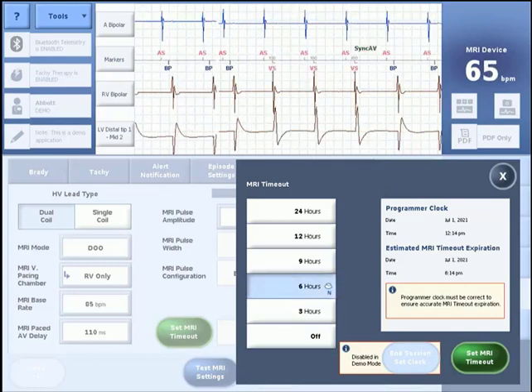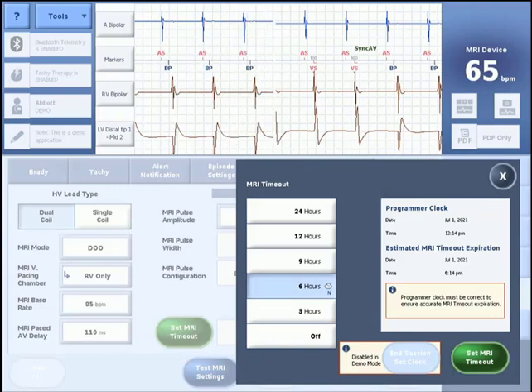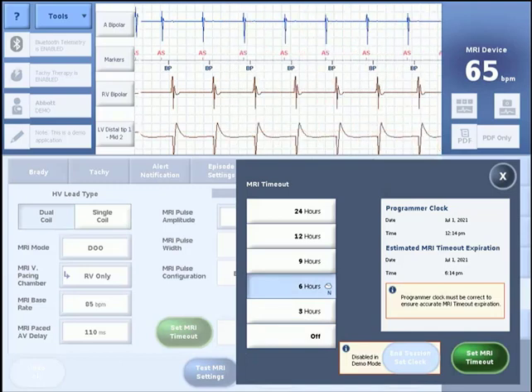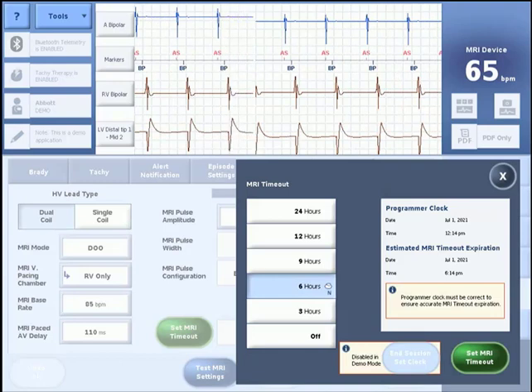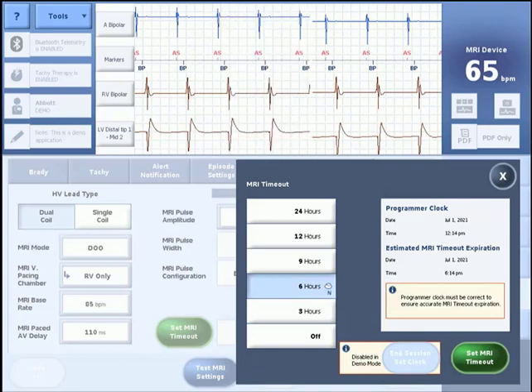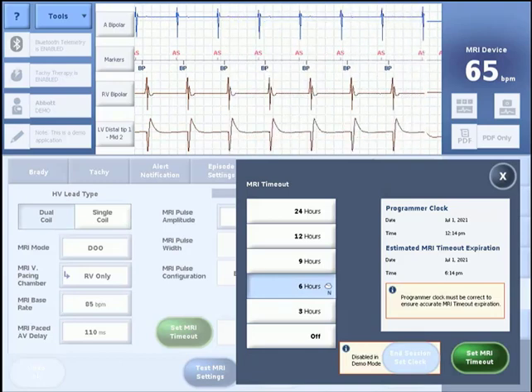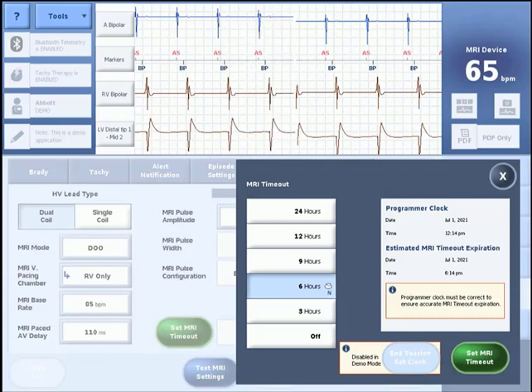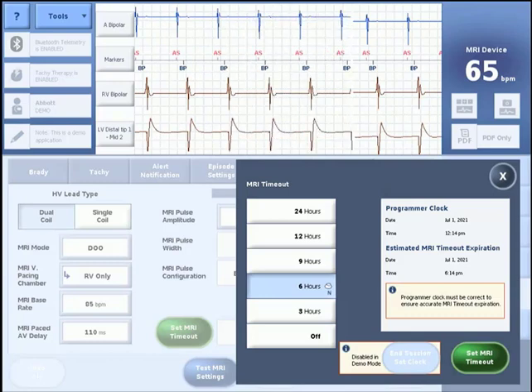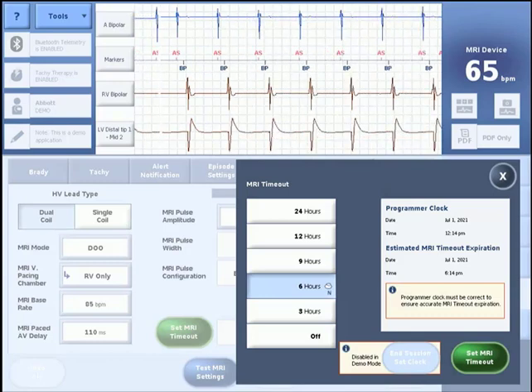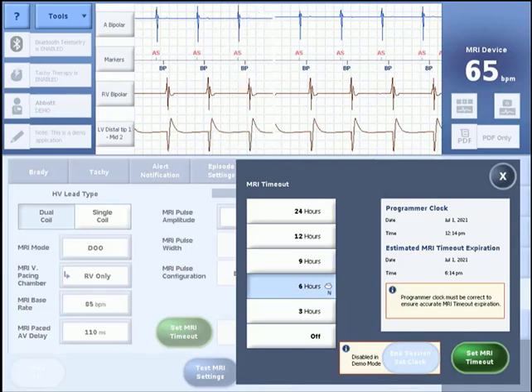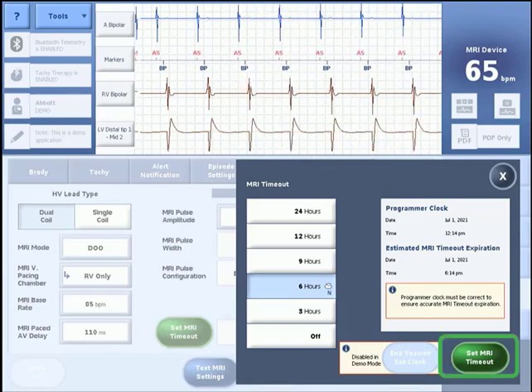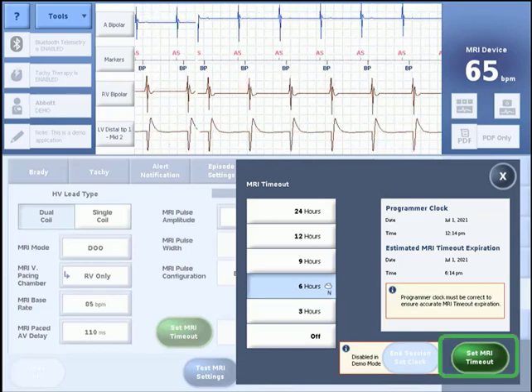It is important to remember that a patient will not receive any tachycardia therapy as long as the device remains in MRI settings. Even if an MRI timeout duration is chosen, it is recommended that the patient's device is interrogated following the completion of the scan so that they can be put back into permanently programmed settings and therapy can be re-enabled. Once a setting for this parameter is chosen, click the Set MRI Timeout button to continue.